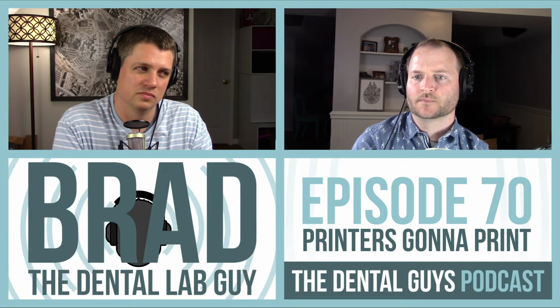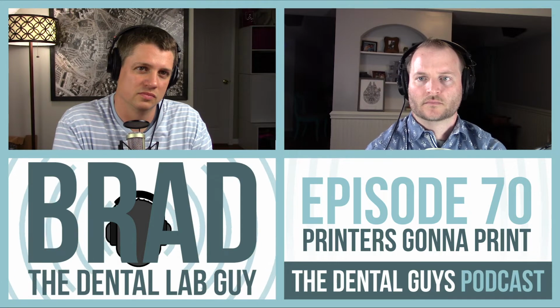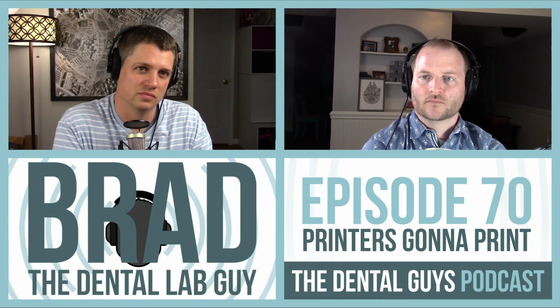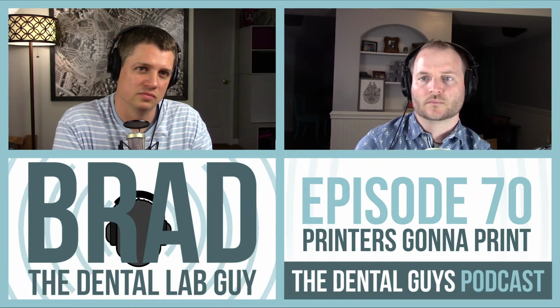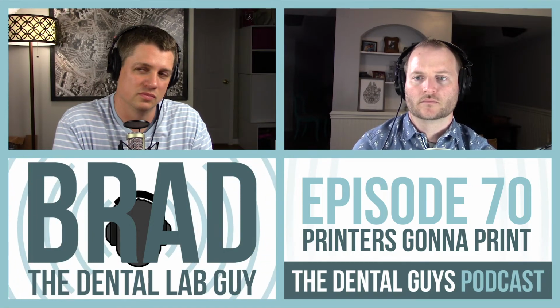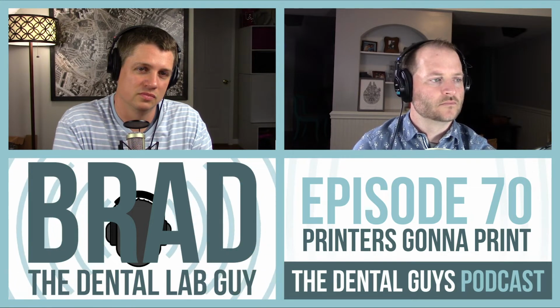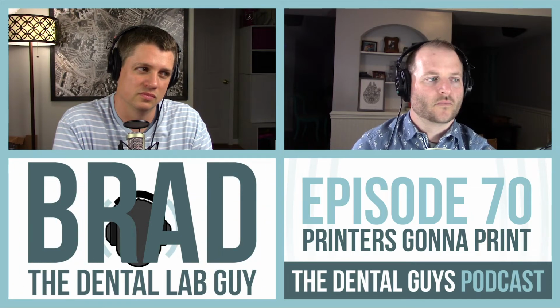Yeah, I think accuracy within a millimeter to a millimeter and a half. What I mean by that is accuracy when you place that implant and compare it to the plan. I think those printers could get you semi-close to that. I don't think I'd plan an implant that's real close tolerance using them. You'd want to have some fudge factor within your placement. But yeah, I think you can get away with doing surgical guides.